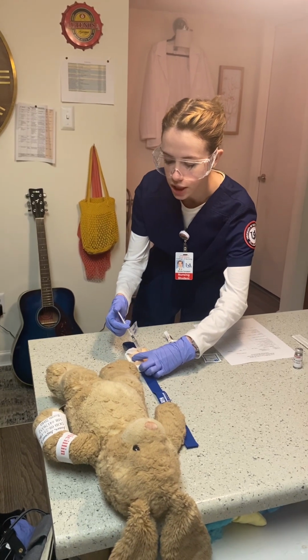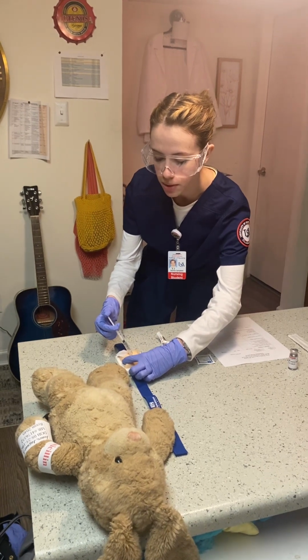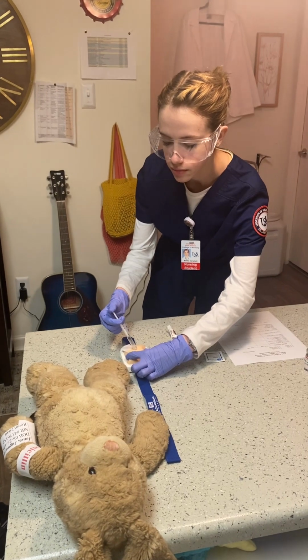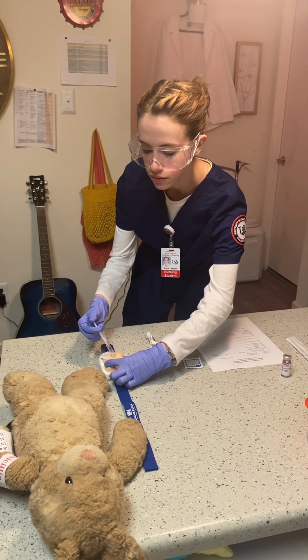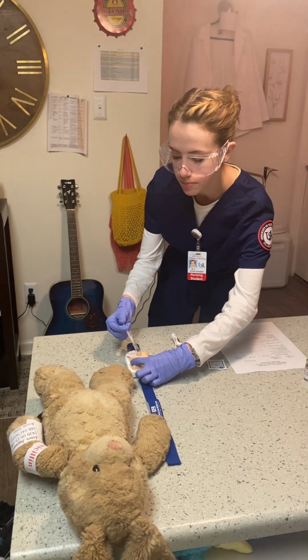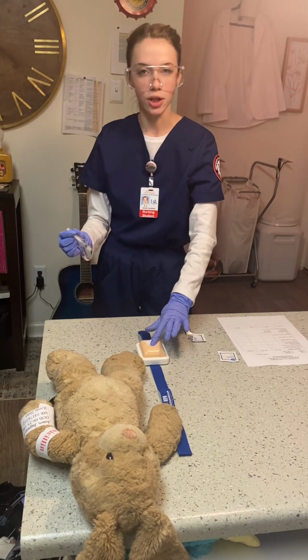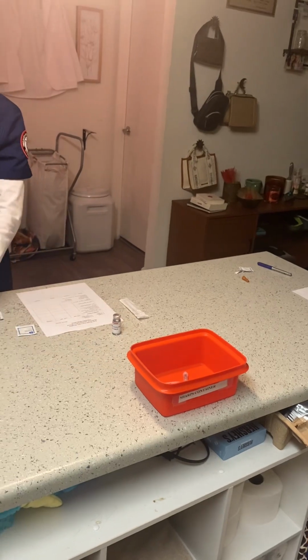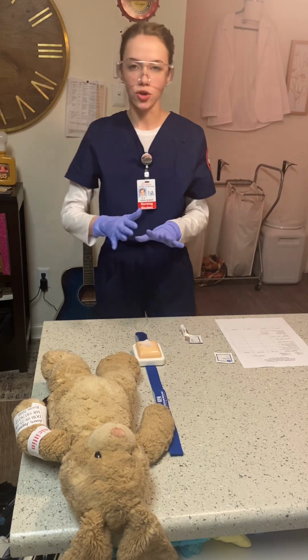And I'm going to push the medication through slowly. With heparin, you typically want to administer this medication over 30 seconds. I'm also making sure not to aspirate due to this medication being a subcutaneous medication. So now I'm going to apply some pressure with my alcohol pad, and I'm going to dispose of my needle into the sharps container. After I have applied some pressure, I'm going to make sure not to massage the site.